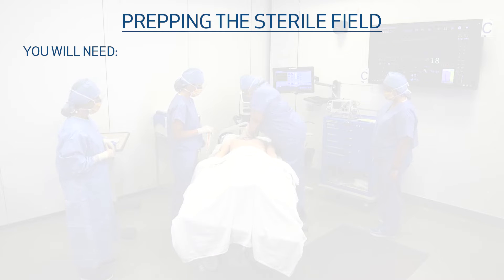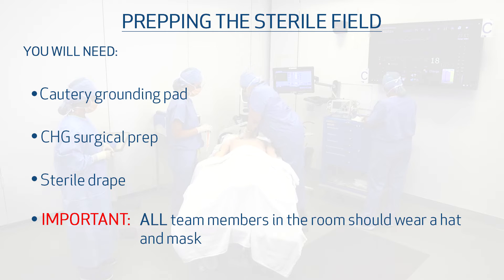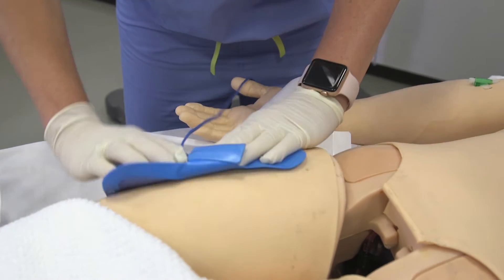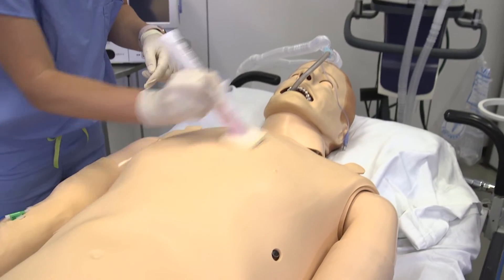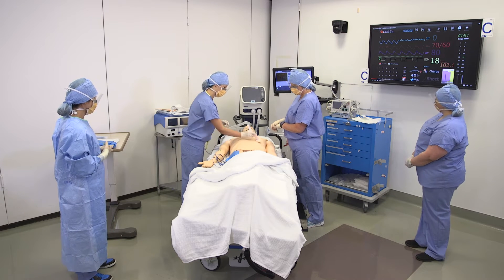We will now prepare the sterile field. You will need the cautery grounding pad, chlorhexidine surgical prep, and the sterile drape from the emergency open chest cart. All team members in the room should wear a hat and a mask. A team member will apply the electrocautery grounding pad to the patient's thigh and plug it in, then apply the chlorhexidine surgical prep. Another team member will put on sterile gloves and will resume CPR if needed.